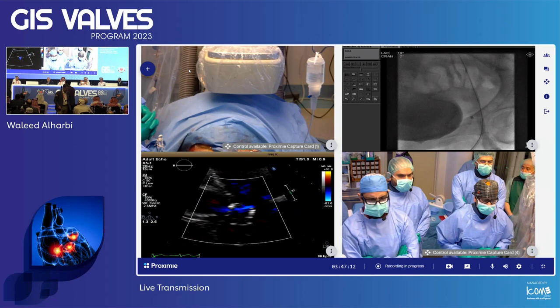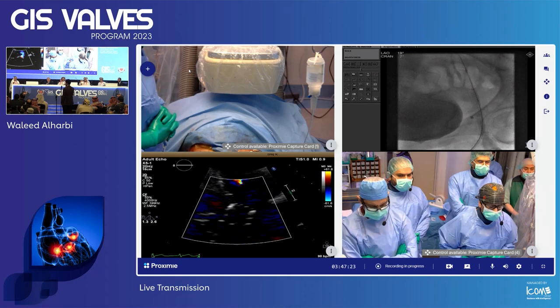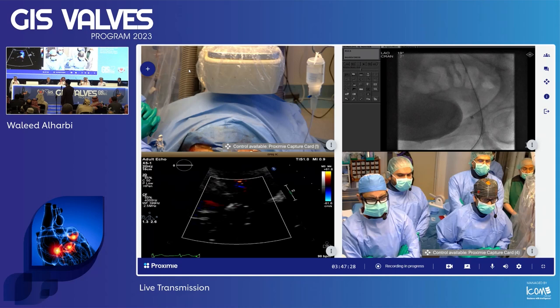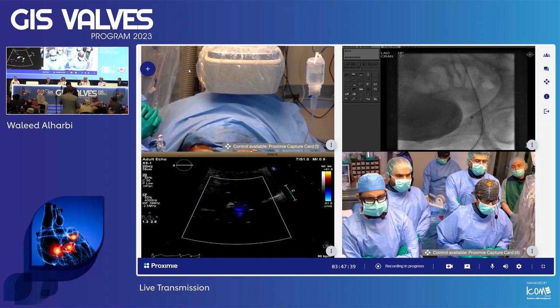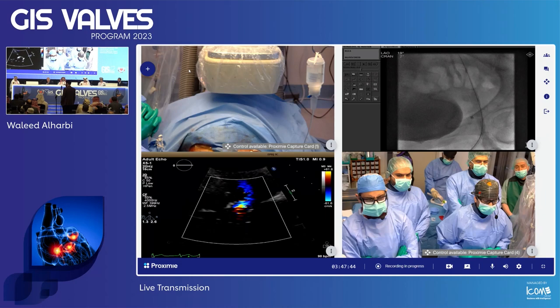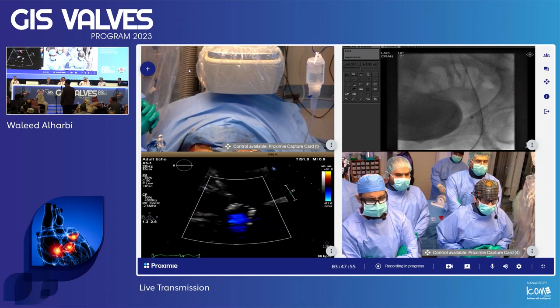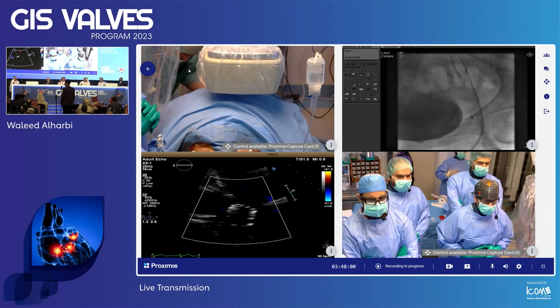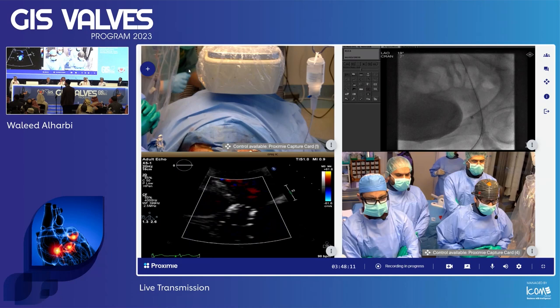Great results, Dr. Waleed and team. Comments on access: the more we use radial and femoral, the fewer complications we have. Regarding small annulus — the OCEAN TAVI trial defines very small annulus as under 314 mm², which is well below this patient's 380 mm²; she is more at the upper limit of the small annulus range in trials up to 400 mm². The balloon expandable choice is good for future coronary access. Some advocate post-TAVI coronary access assessment to document catheter approach for the known LAD lesion.